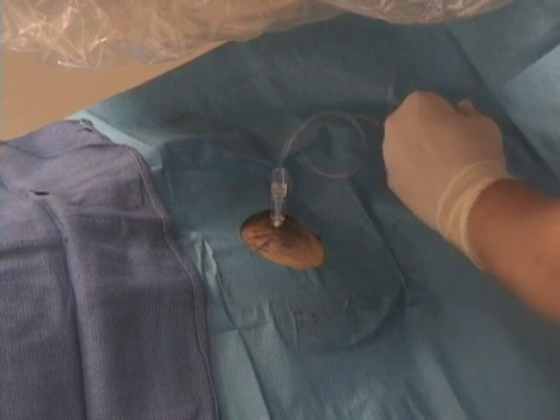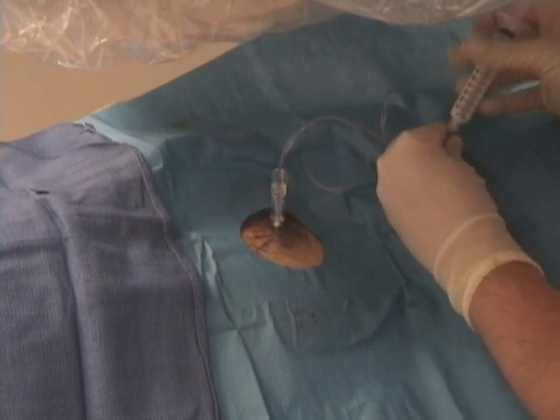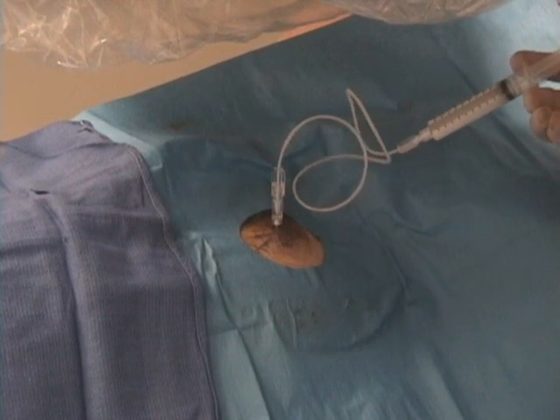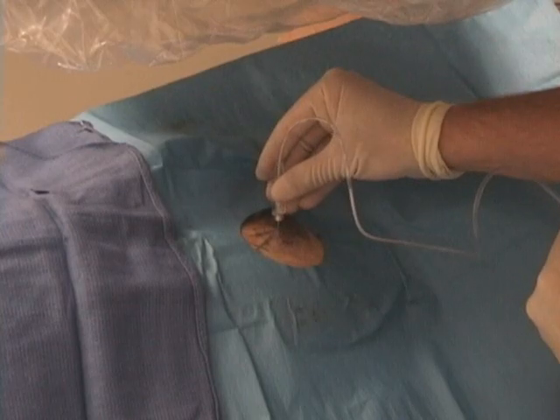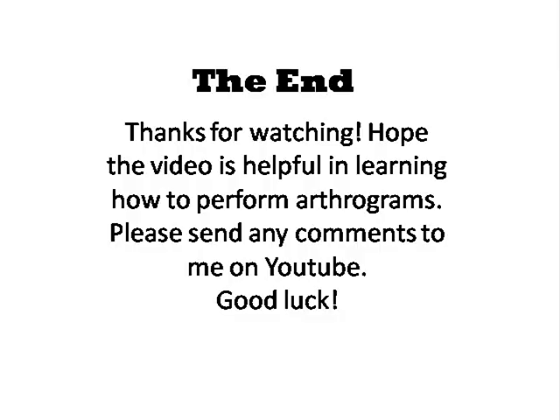Disconnect the Conray from the back end of the tubing, and then connect the Magnivist. In this case, we have also mixed in steroid with the Magnivist, which gives it the white color. Finally, you should see a diluted result such as this, which indicates a good injection. Remove the needle, apply pressure, and place a sterile bandage.